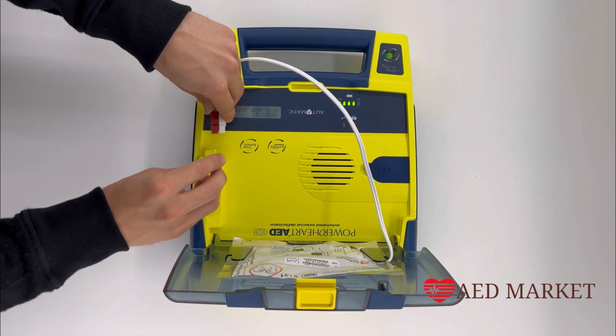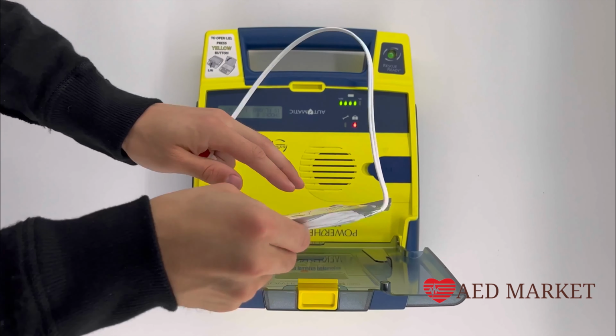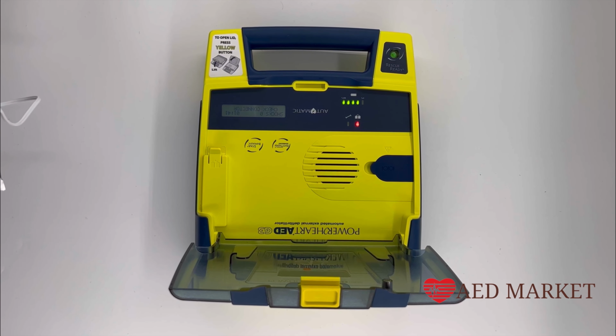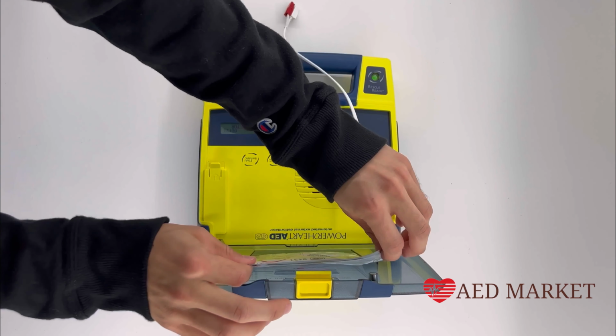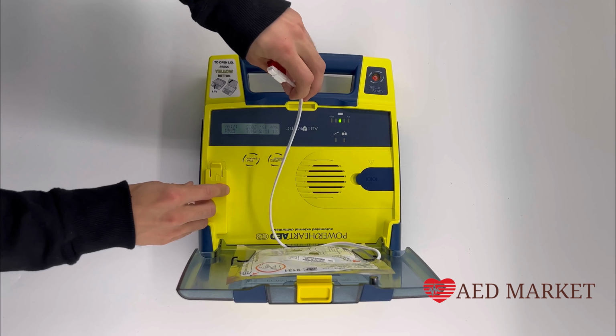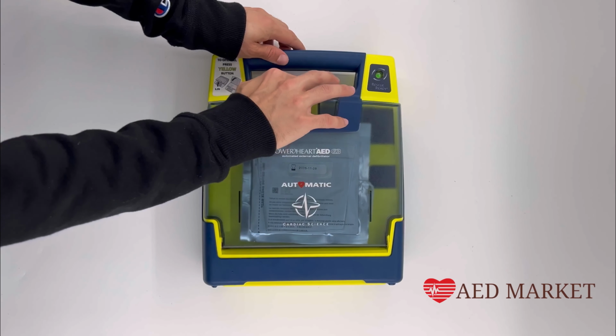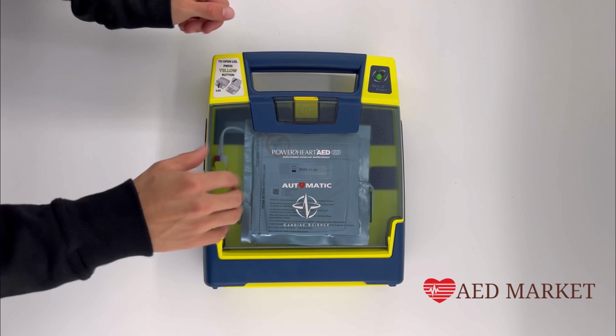These pads come with a 2-year expiration date, indicated in 2 different locations, one on the front and one on the back. It's crucial to replace the pads before this expiration date or if the AED is used for any reason. When inserting the new pads, make sure to align the red and white connectors correctly. Plug them in and securely place them in the designated pocket before closing the lid.